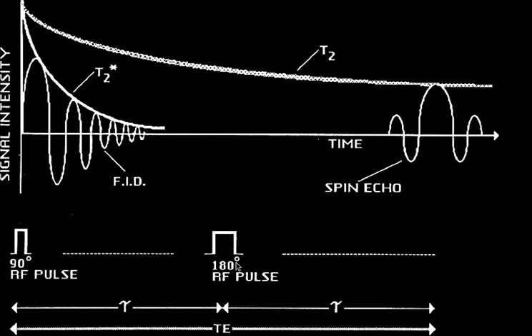That's right. The time independent one is a variation over distance, from place to place in the body, but it does not change over time. And because it doesn't change over time, the 180-degree spin echo will completely correct for it, and we can then get a signal back from those nuclei in the echo.